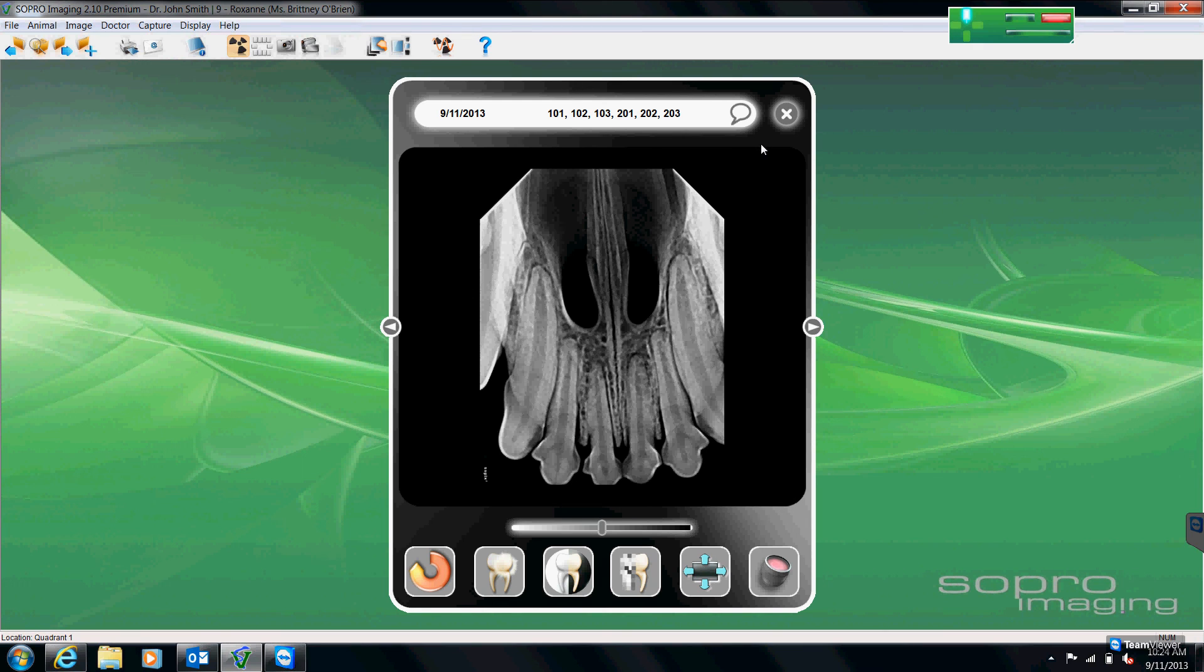These are the three basic ways that we can go about numbering the teeth that are in our image. Thank you.